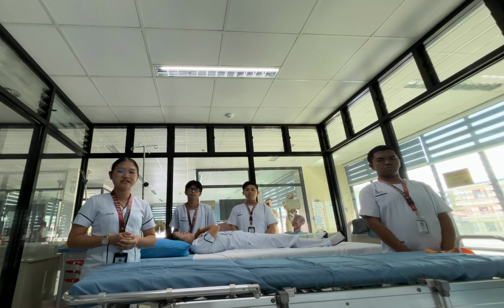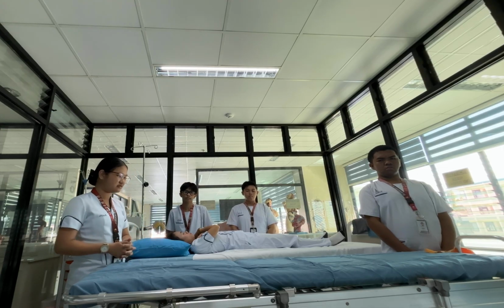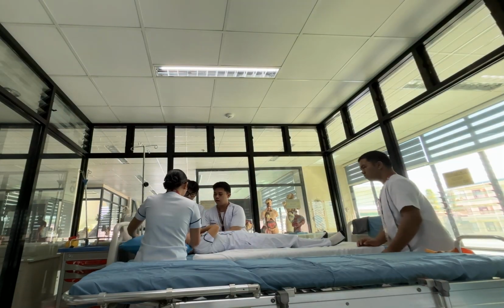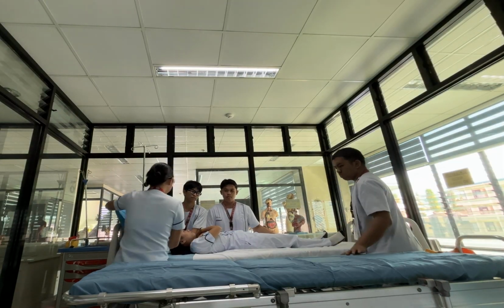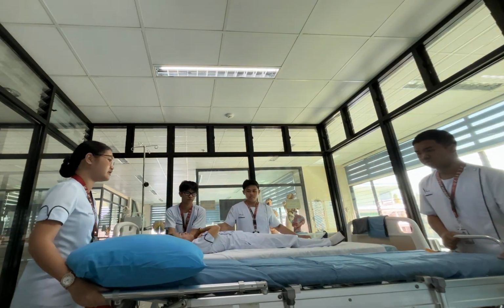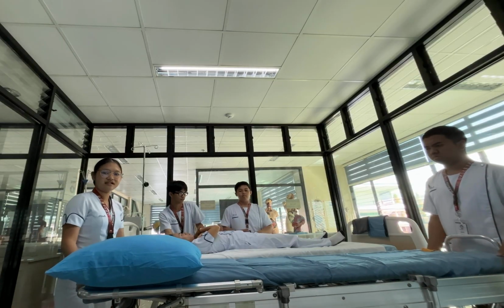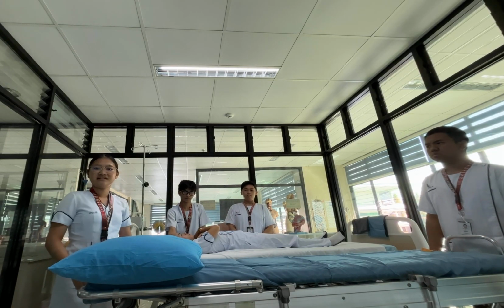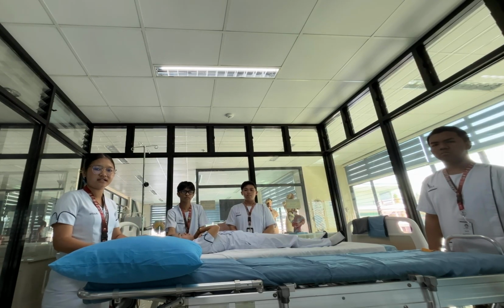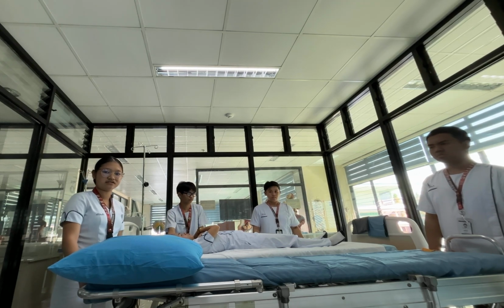Then two nurses should stand beside the stretcher. The third nurse should stand on the side of the bed. Then the first nurse beside the stretcher must reach across the stretcher and grasp the draw sheet at the head and chest area of the patient.